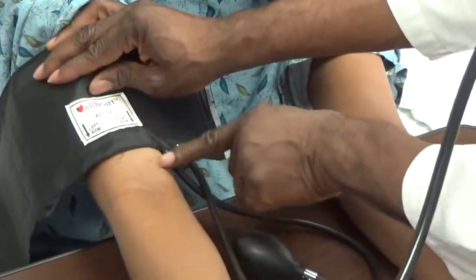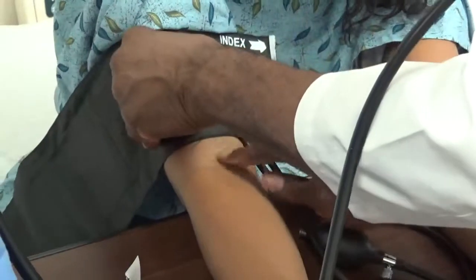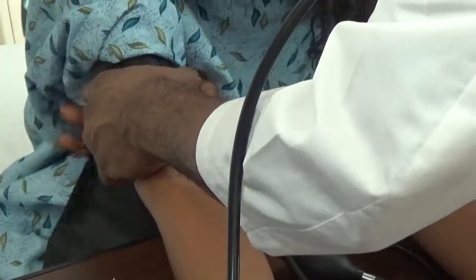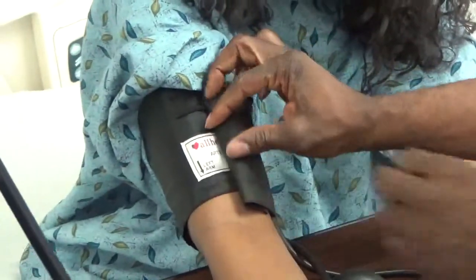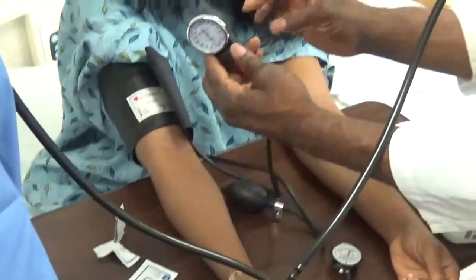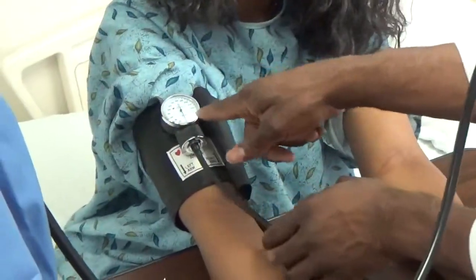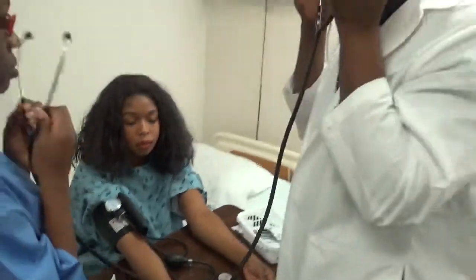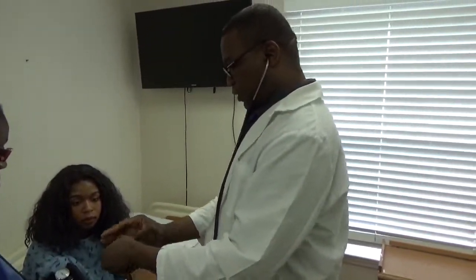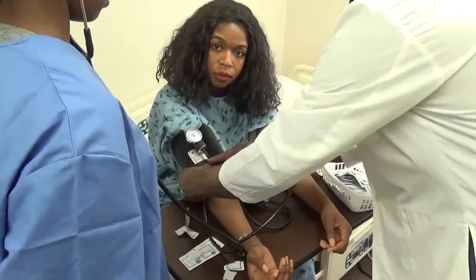Make sure you leave some space for the stethoscope — don't wrap too low. Take the cuff up a little bit so you leave space for the stethoscope. Make sure you wrap it tight enough — not too tight and not too loose. Then place the meter, press that, and hook it underneath so that both you and the examiner can see the reading. Now put the stethoscope in your ear, and place the bell right there — support it and make sure it is covered completely.